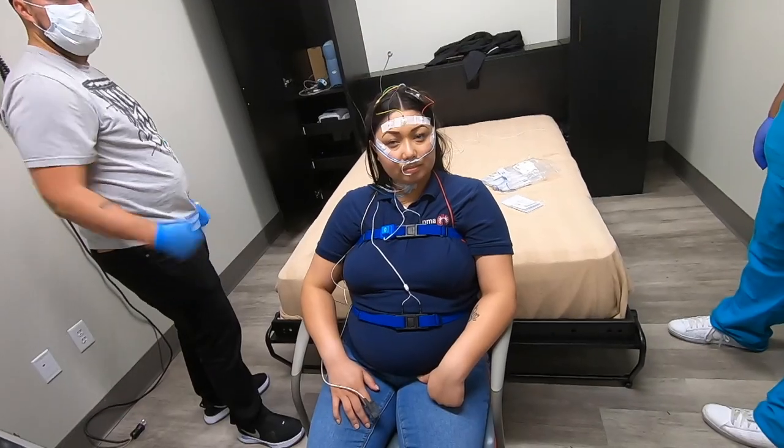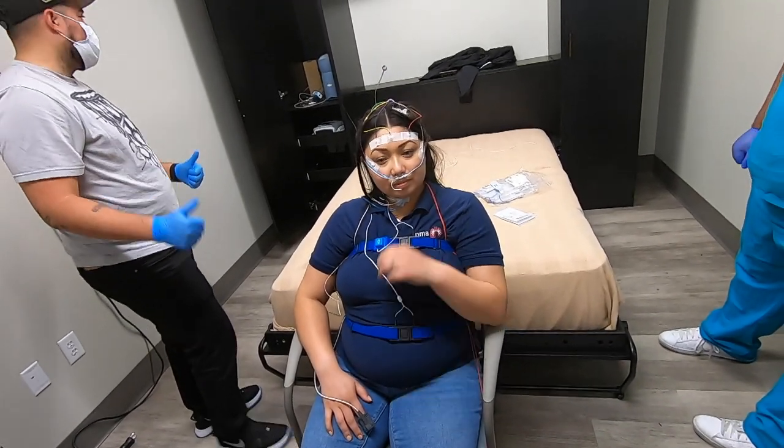Also missing are the chin electrodes. Those help with bruxism or teeth grinding, as well as REM sleep onset.